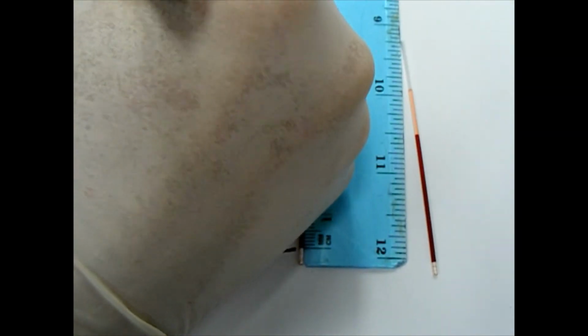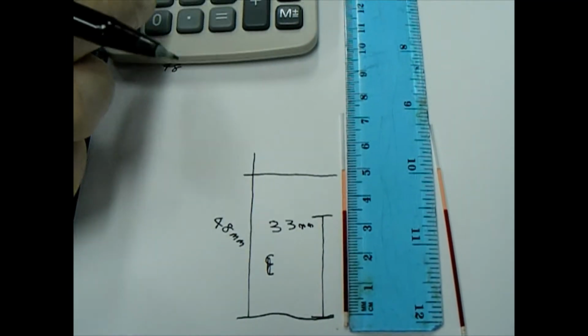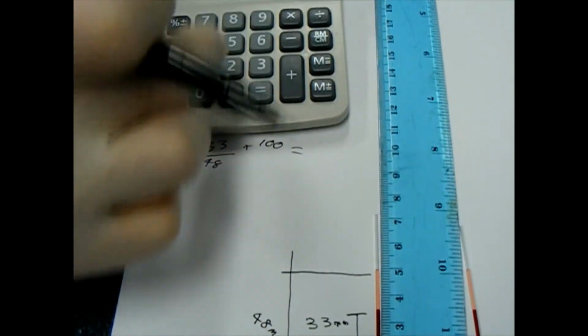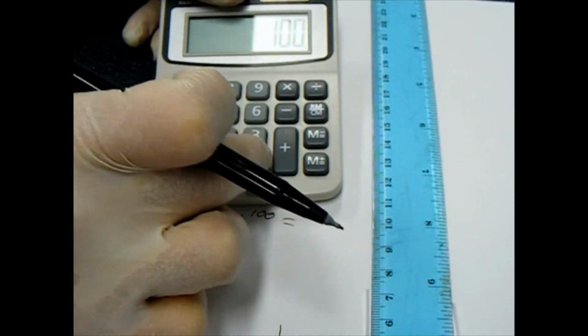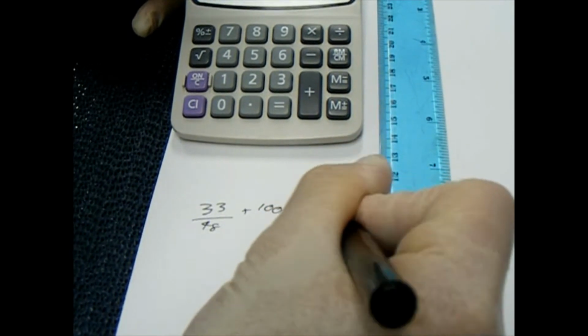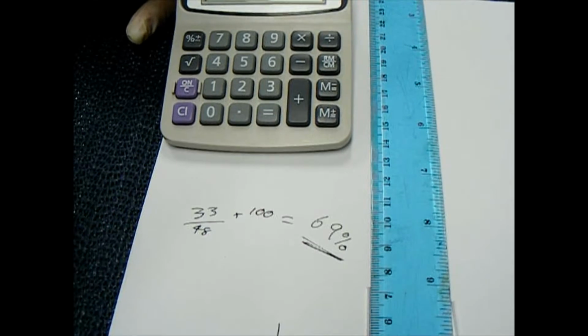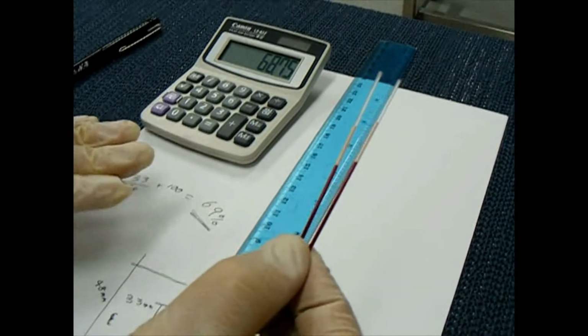Once we've done that, this is what we do. You do 33 divided by 48 times by 100, and that is going to give you the answer, the PCV, as a percentage. So 33 divided by 48 equals, times by 100, the answer is 68, you round it up, which is 69%. That's a very high PCV, but that's what the answer is, 69%. So this is the manual method.